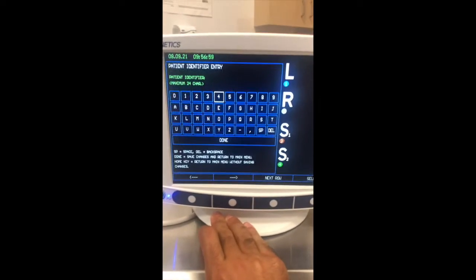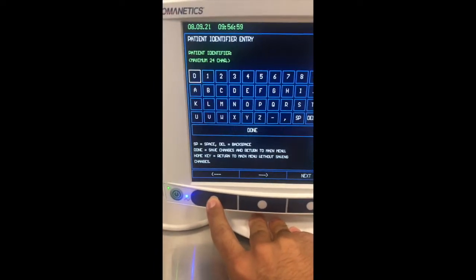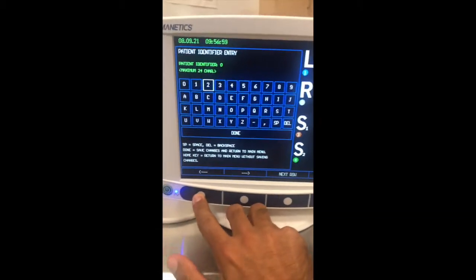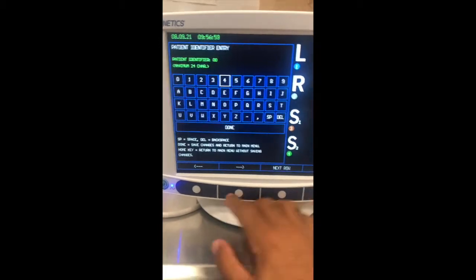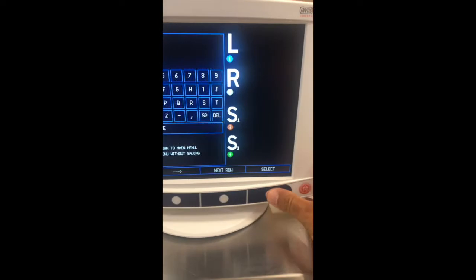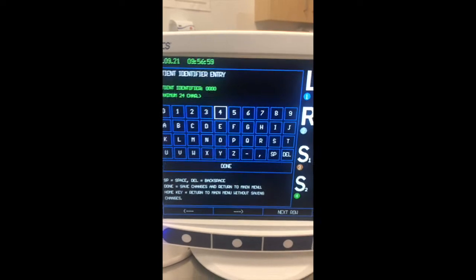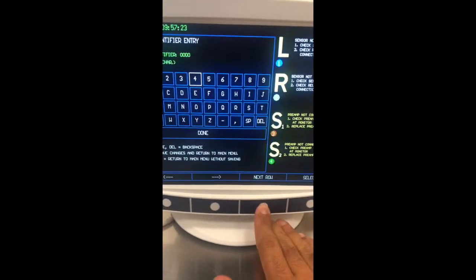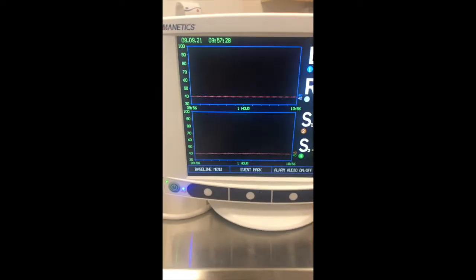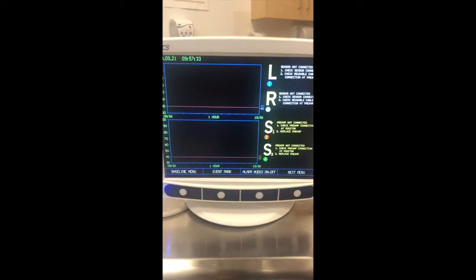Typically what we would do is enter the MRN number using the arrows to select digits. Here I'm using an MRN of zero, zero, zero, zero as a demonstration. You can see that the patient identifier shows four zeros. Then navigate with next row and select done. The data will now be recorded under patient 0000.